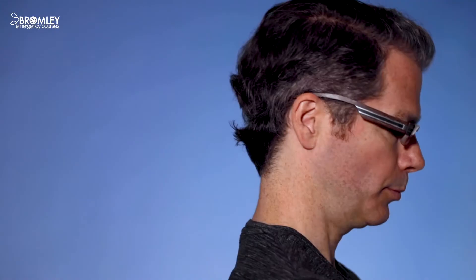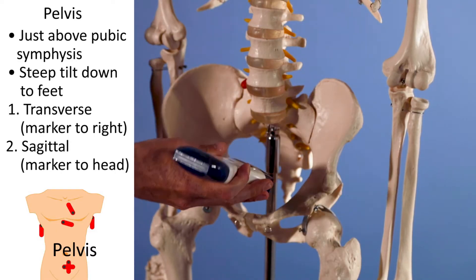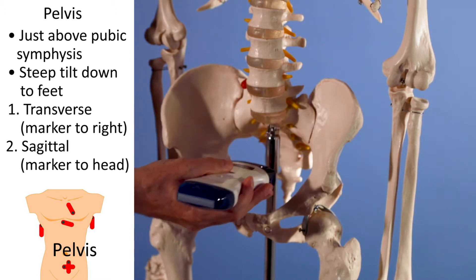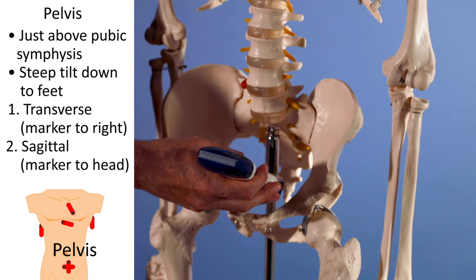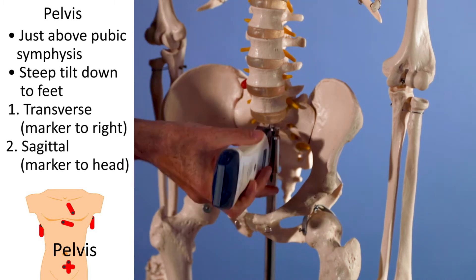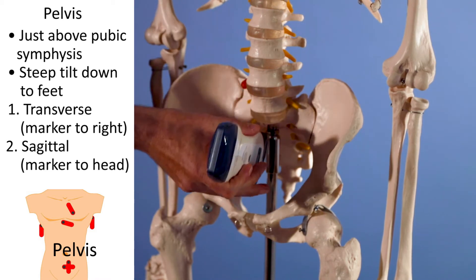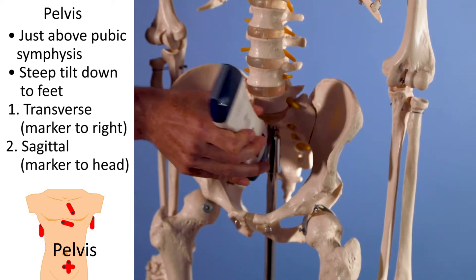The third component of the E-FAST exam is the pelvis. Place the probe just above the pubic symphysis — often you have to tilt quite steeply down into the pelvis, not straight across the abdomen but actually tilting the probe down towards the patient's feet. Start in a transverse orientation with the marker to the patient's right, then rotate the probe through 90 degrees so the marker is to the patient's head. In each of those planes, fan through, shining the beam all the way through this whole region, not just getting one single image.